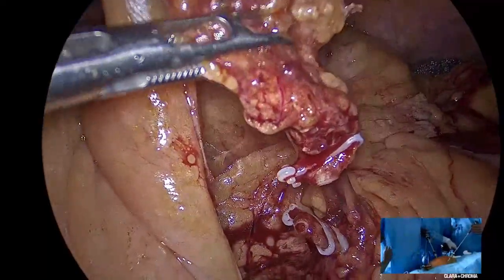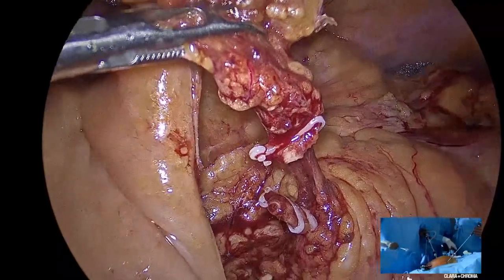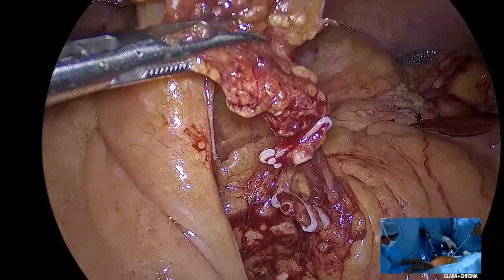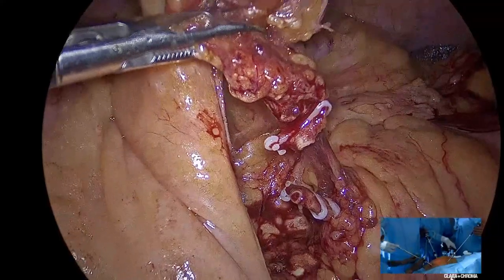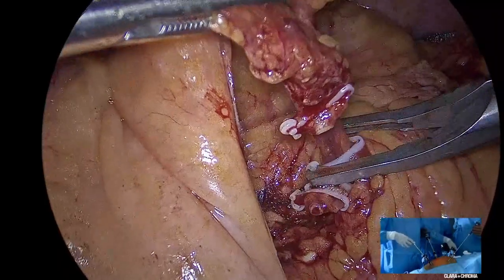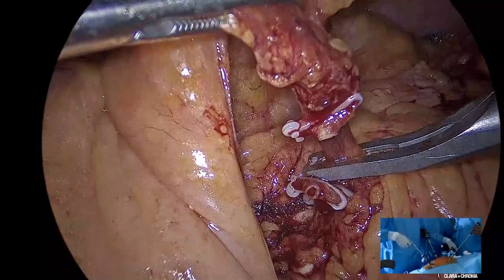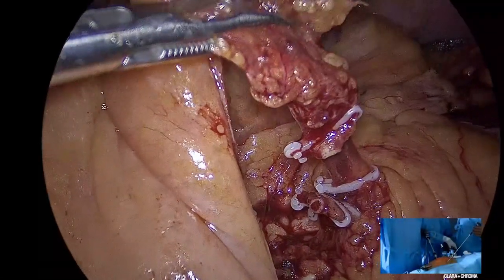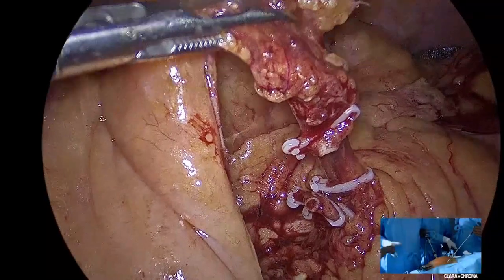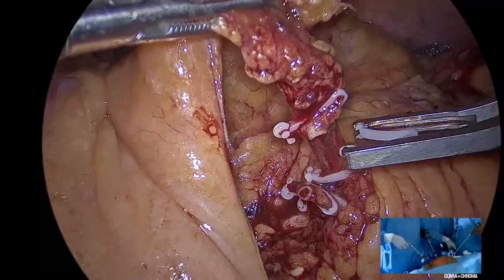You can see the lumen of the ileocolic trunk, such a large vessel. So Dr. Jameel has taken the artery first, which is pulsating now over the clips. And now he'll take the vein, because by the time you clip the artery and divide it, the vein shrinks inside. One more. So it's two proximal, one distal for both? Yeah.